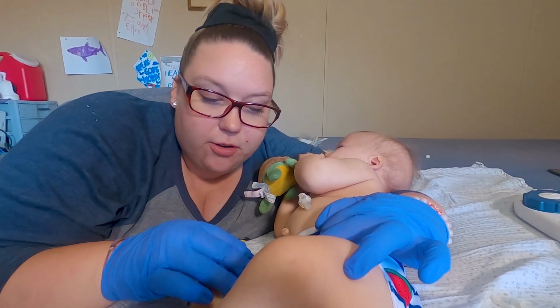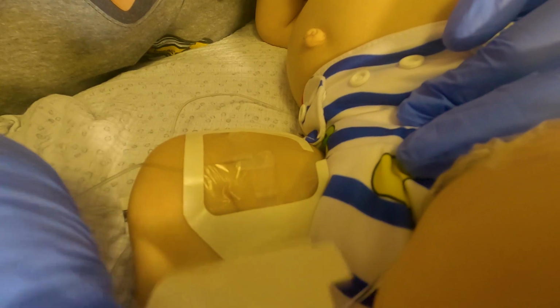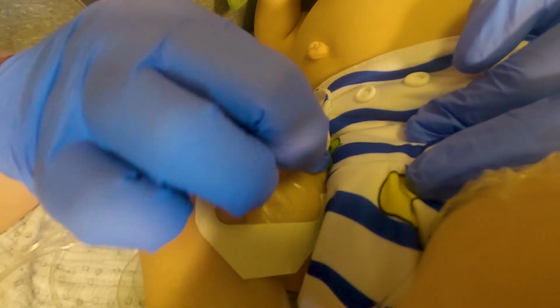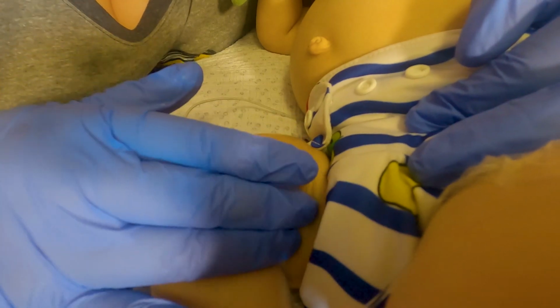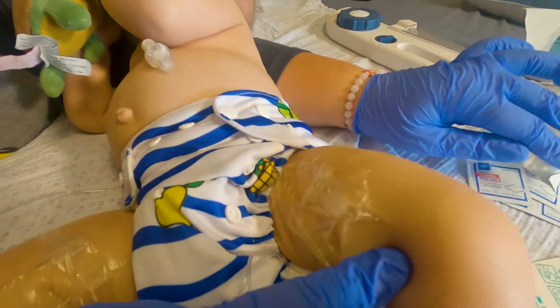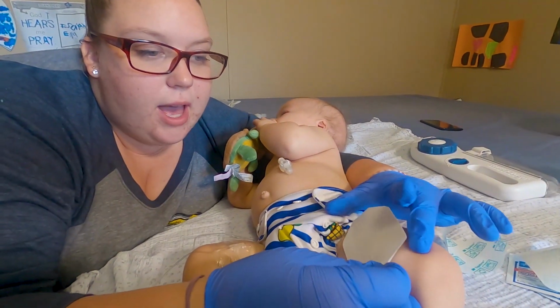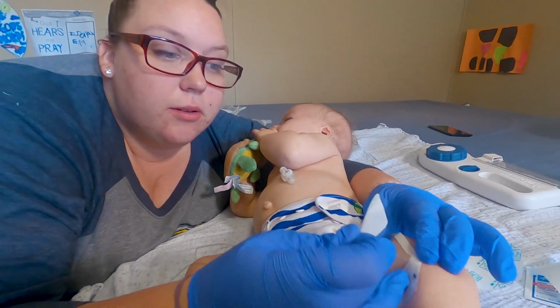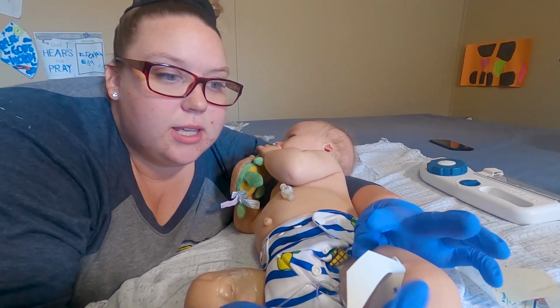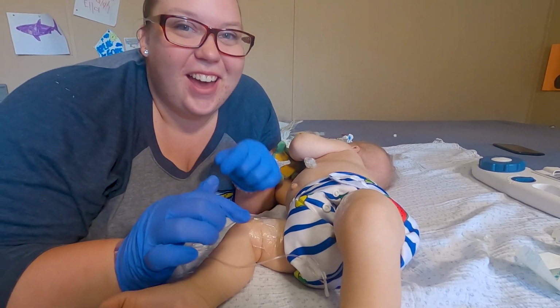So these Tegaderms are different. Can you show the Tegaderm? Okay, so this one has a window you peel off, and then you peel off the sides around it. He's a pretty sweaty boy, so I put on multiple Tegaderms. See, like this one is starting to come up already. So I'll put another Tegaderm on to make sure everything holds because we do not want him getting an infection. Whether you have a heart baby or a thymus kiddo that has no immune system, it's always important to keep stuff covered and keep things sanitary. I've learned a lot from all of our lovely nurses. Okay, you see that it's on really good.